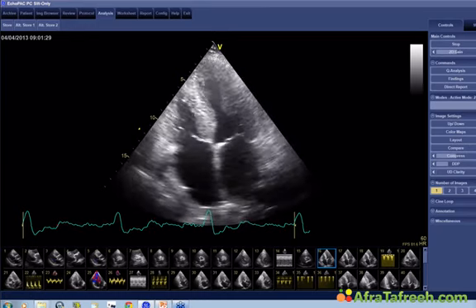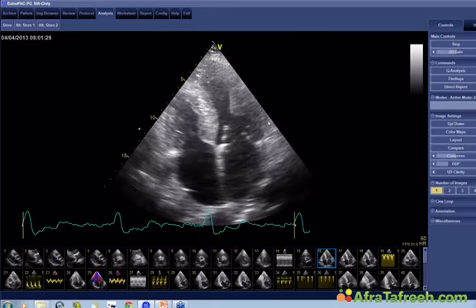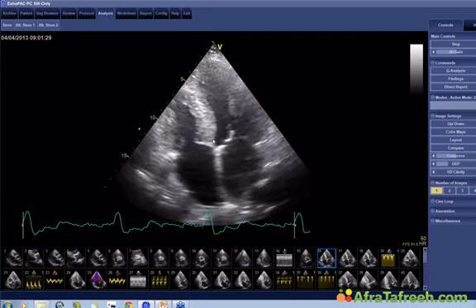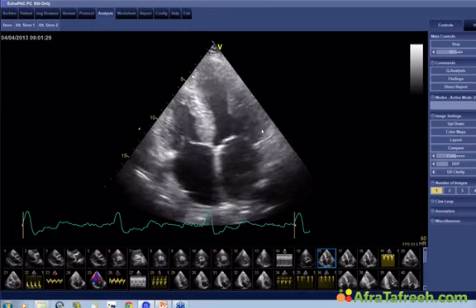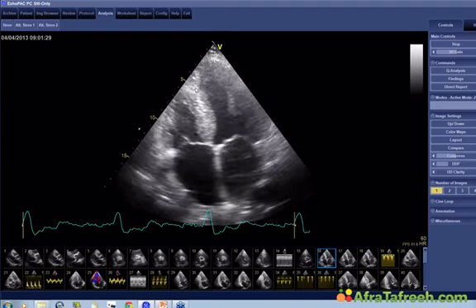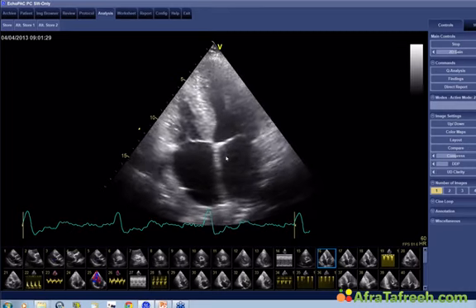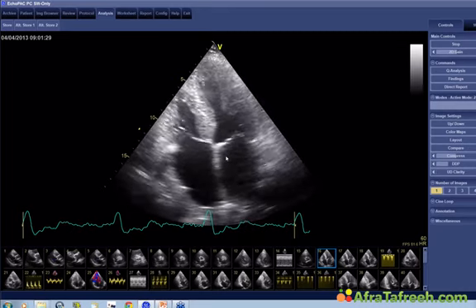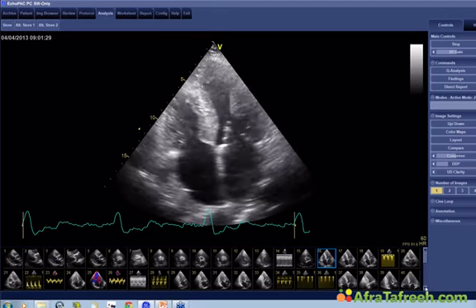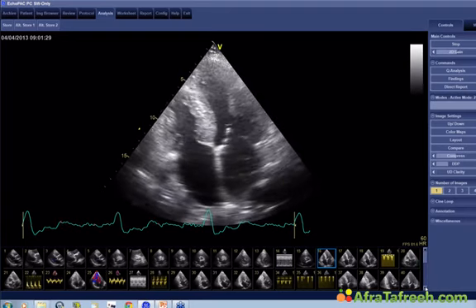So I think in his case, the main problem is that he has a damaged ventricle caused by hypertension, probably also coronary artery disease, as we later found out he did have three-vessel disease, and that is his main problem, and not so much aortic stenosis. Sure, aortic stenosis, as we think it is mild or maybe mild to moderate, plays an additional role, but it is probably not his main problem. And this information is very important because I do not think that he would benefit from aortic valve replacement.